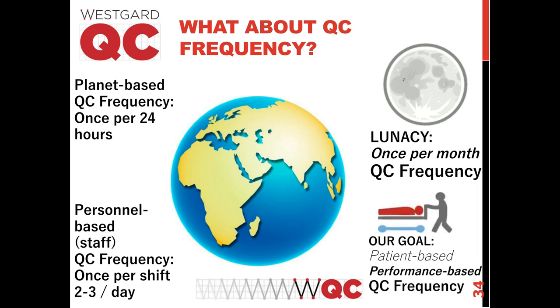Where we should really focus our QC frequency is around the idea of patient risk, patient-based QC frequency. Patient-based QC frequency, which also has to be performance-based. That is, we know how good the test needs to be, we know how well our instrument performs, and those two things drive how often we need to run QC.